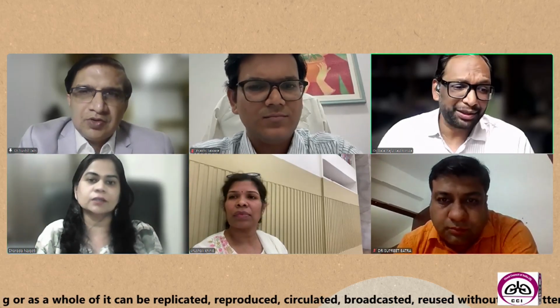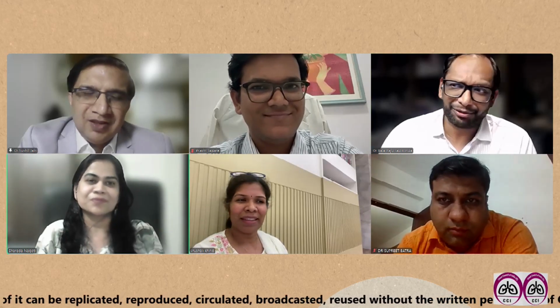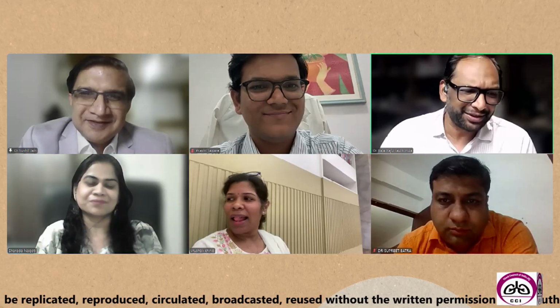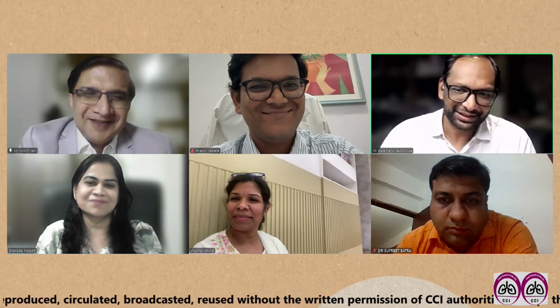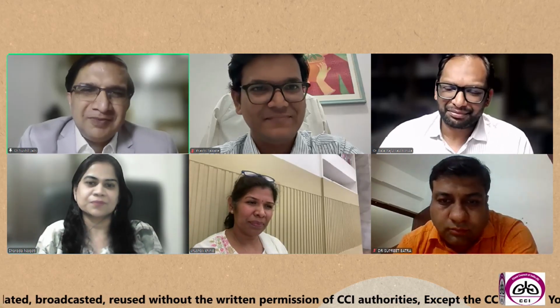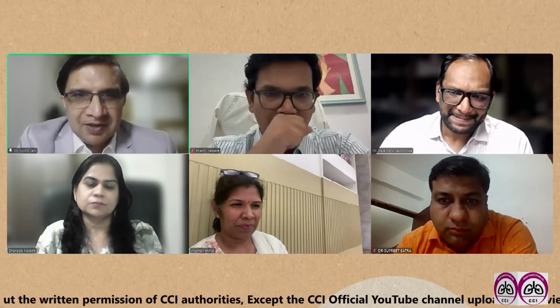Absolutely, my pathologist has told me the same thing. When I asked for flow cytometry, he said just leave it, do a cryobiopsy and give it to me. So for difficult cases, lymphomas and benign conditions, all of us are switching towards cryobiopsy, and in those which are negative on EBUS, cryobiopsy may help.